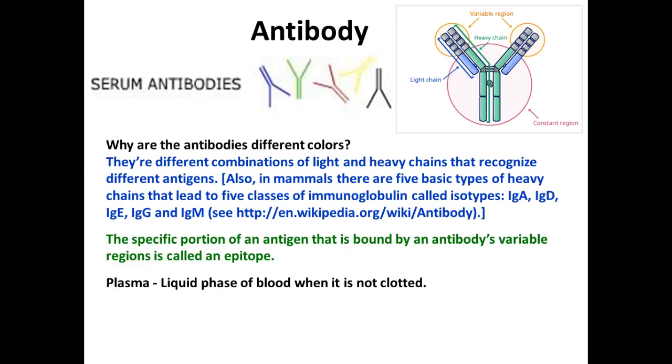As an immunologist, I would kind of snicker at my boss when he would give me plasma. And the reason why he would do that is because he only wanted to take 1 tube from the animal, right? So he'd run a whole bunch of tests, CBC count, all these things on that non-coagulated blood. And then they would spin it down and give it to me so I could pull off the plasma and test for the antibodies. That was because, again, they just wanted to take 1 tube from the animal.